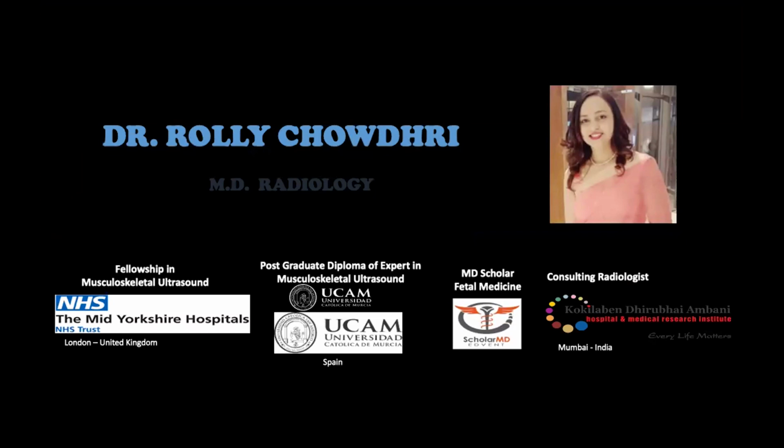After a comprehensive evaluation of the popliteus tendon by Dr. Satish, it was wow. I've never seen such good images. You explained it beautifully. So now we are looking at some common cases. It's a mixed bag of cases which we have done. We have evaluated it, and post-operative follow-up is also there.